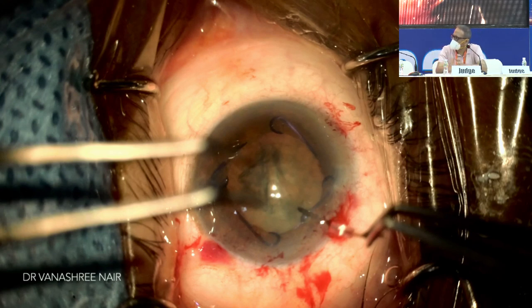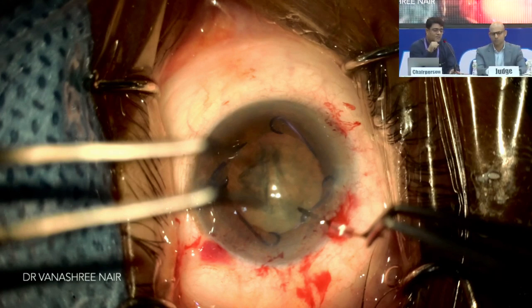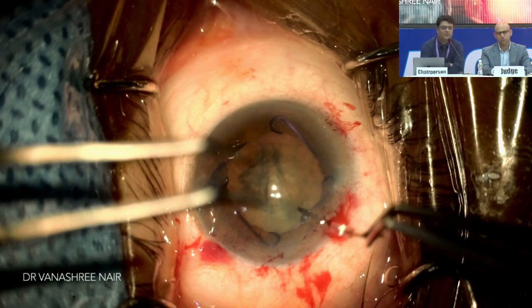Any thoughts, Dr. Harshul? And always use micro capsular forceps, because a cystitome won't help. Absolutely. And as Dr. Rohit said, once you put those hooks, they take off all the forces and anchor it anteroposteriorly. It gives it support and immobilizes it, giving nice counter traction. Let's move ahead.